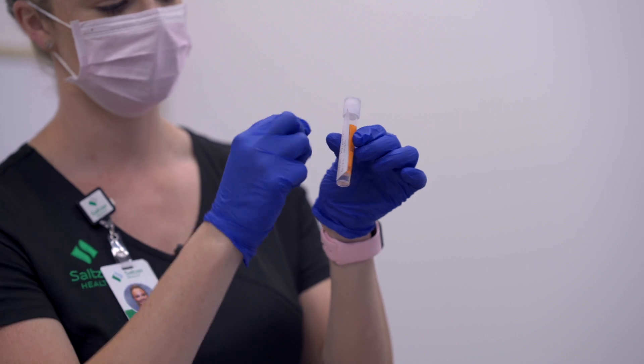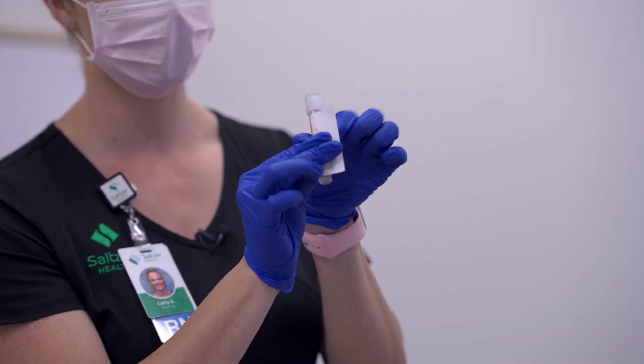You'll want to apply the label horizontally so it doesn't wrap on itself — you want to be able to read the full label. Next you will want to have some tissue handy or give the patient a tissue, as it can make them sneeze or their nose run.